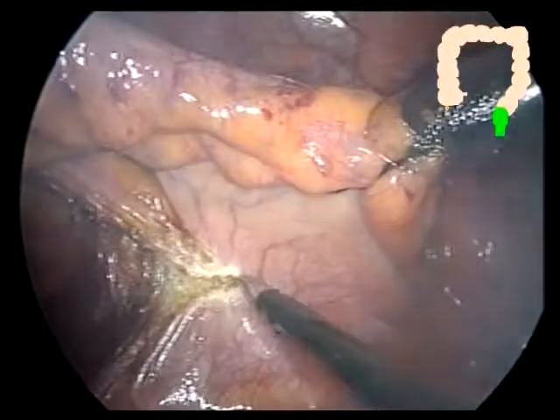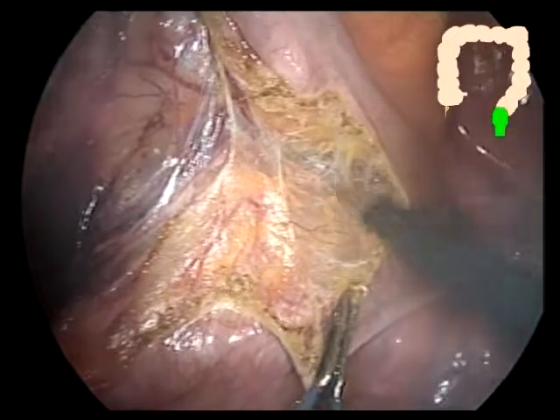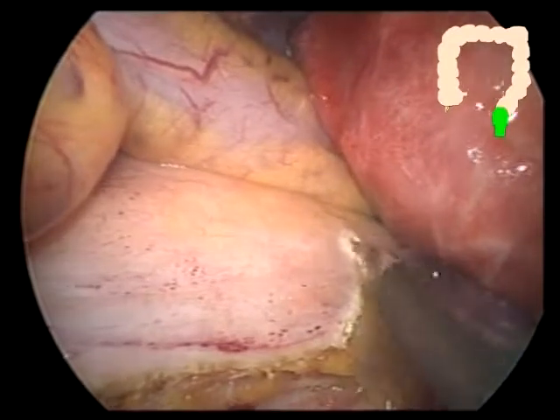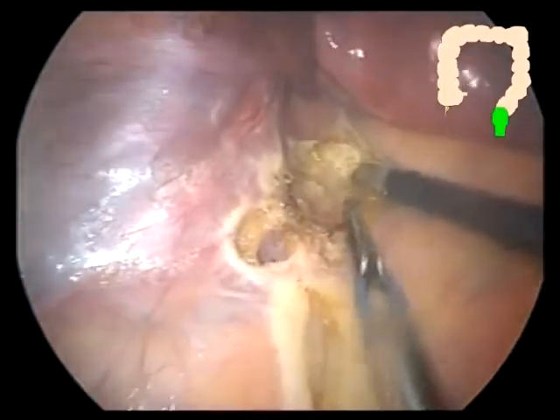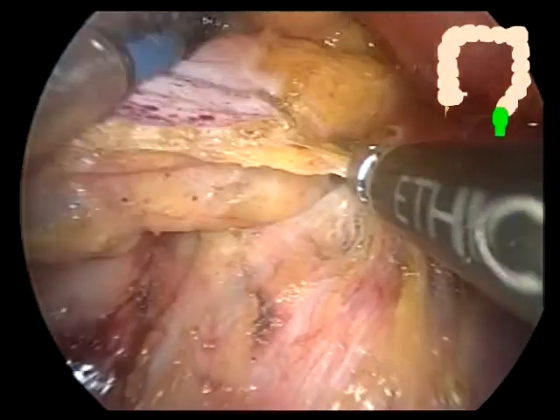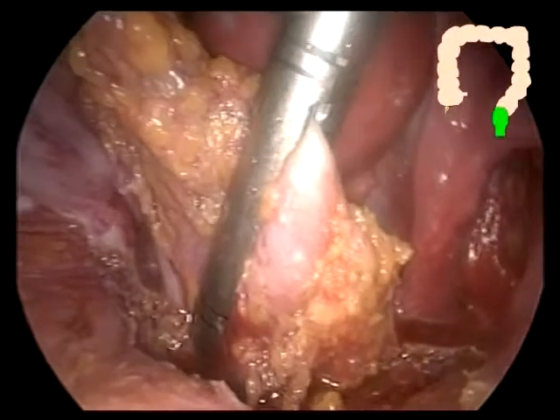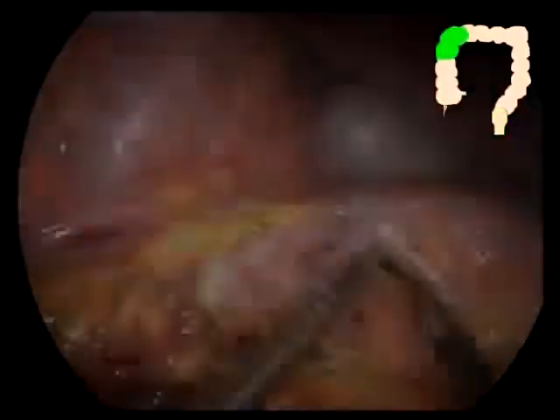The mobilization of the left colon is then completed. The superior rectal resection is performed with an endoscopic 45 mm linear stapler with a green cartridge.